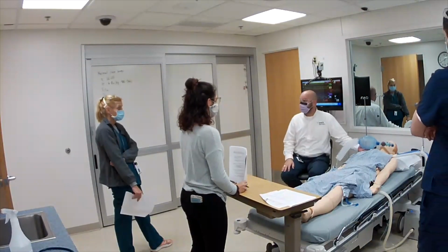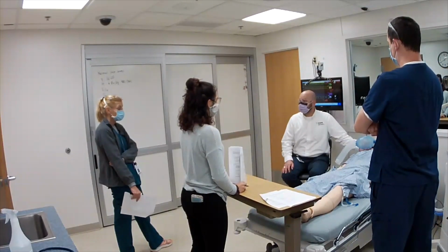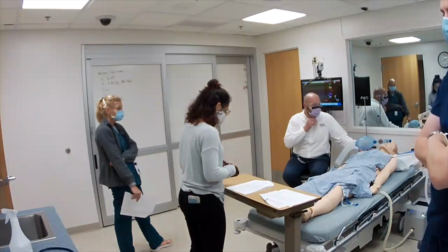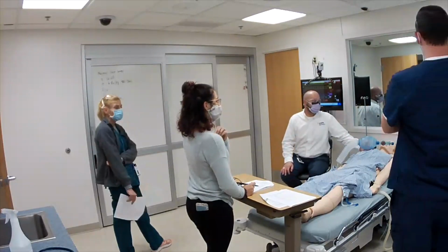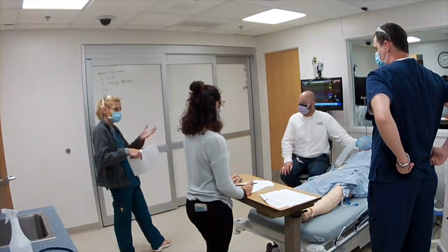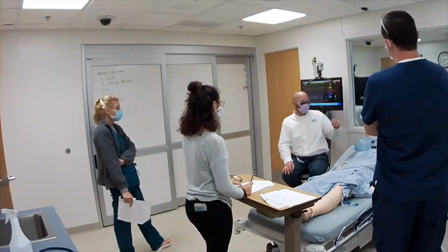Good. So what's the next one on there? Volume support. So what is volume support? Pressure support and the volume. Instead of setting pressure. So we talked about CPAP, but I don't know that we explained it super well. So with CPAP, right, we're just gonna give them a constant pressure in their face, right? So we're giving them extra 10 centimeters of water pressure, right?